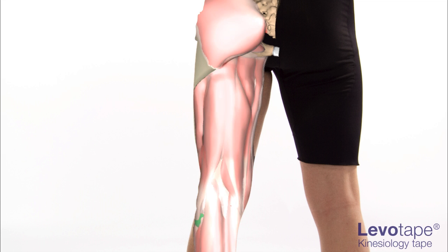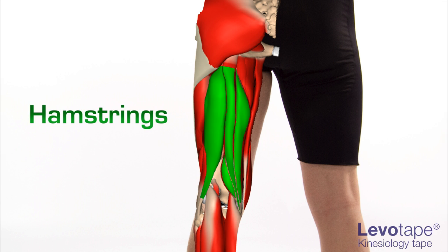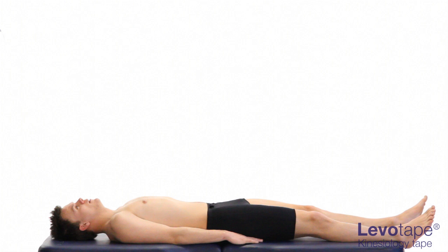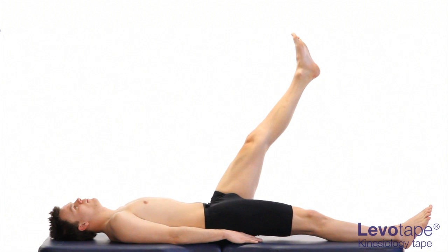This is a muscle taping technique applied to the hamstring group, used to increase straight leg raise, to be referred to as SLR, and to assist forward flexion of the lumbar spine. First, note the patient's restriction of straight leg elevation during the SLR test, which reveals a tightness around the posterior thigh.